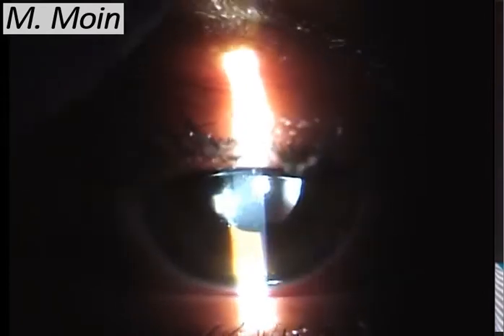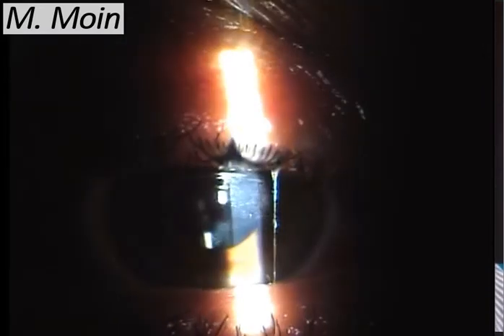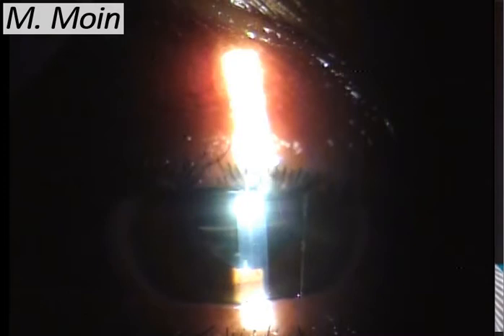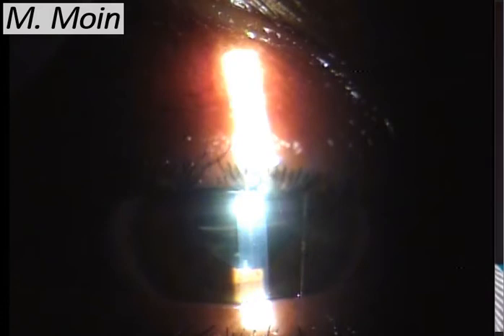This patient is pseudophakic. This is a slit beam examination — you just gently lift the eyelid and look at the vitreous. Sometimes you get just a glimpse of it. Go back slightly and you need to see that glimpse. This is the fluid level of gas which you need to identify fairly soon in these patients.